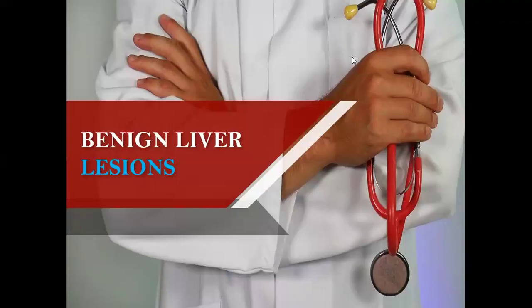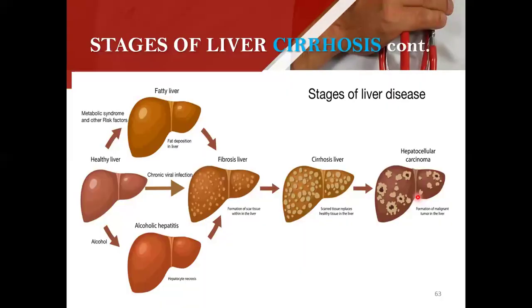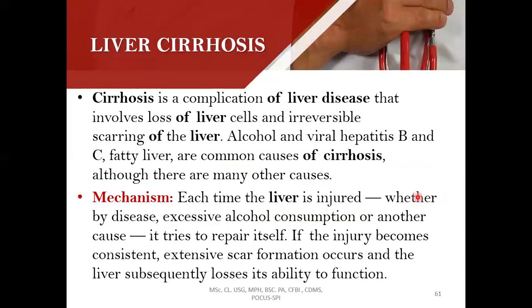All right, so the last time we started with the liver anomalies or pathologies. Yes, and I'm sure we got to liver cirrhosis. Yes. So a quick recap.